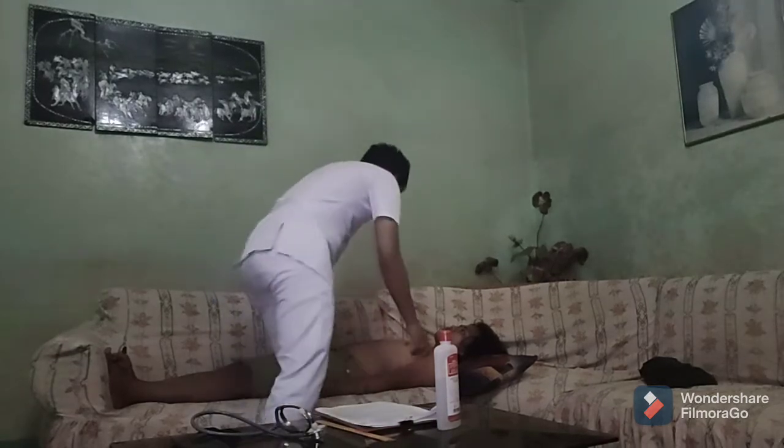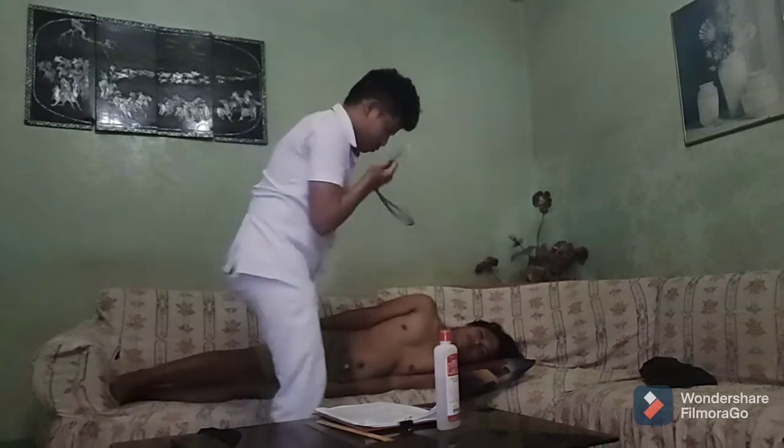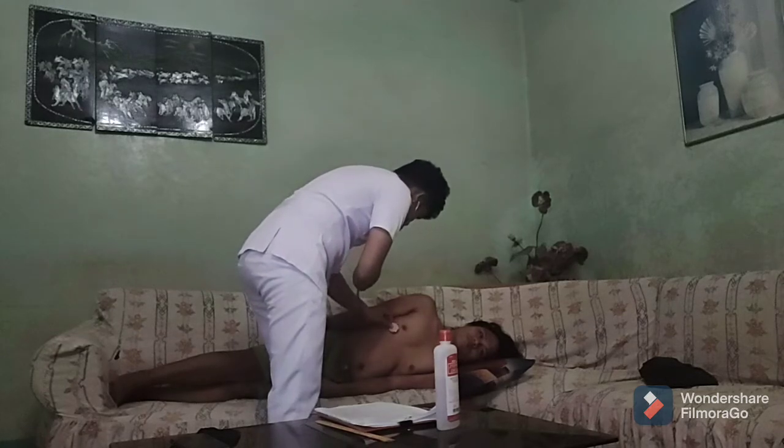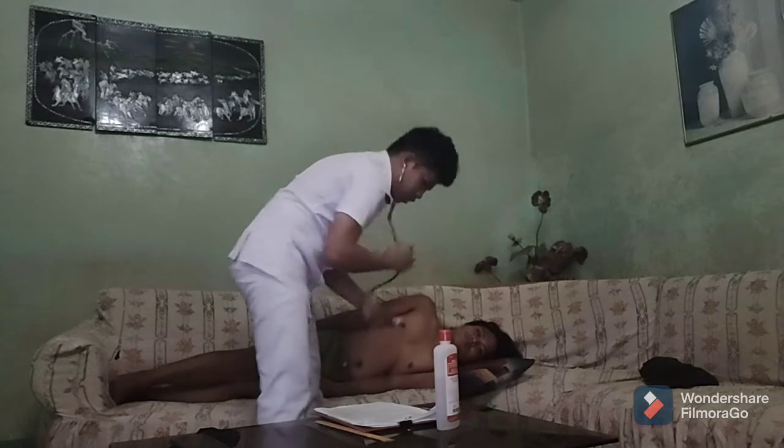So, sir, I am going to assist you on a lateral position, sir. Then, I'm just going to auscultate you, sir.